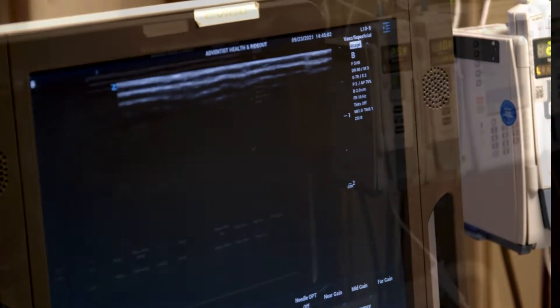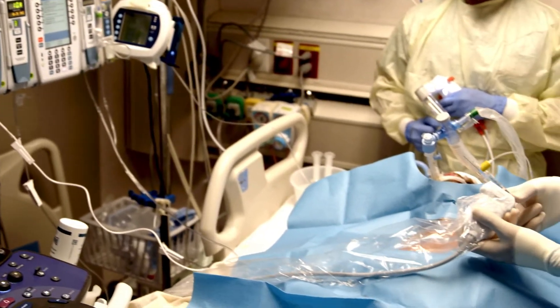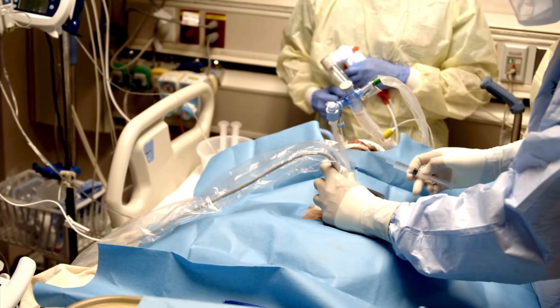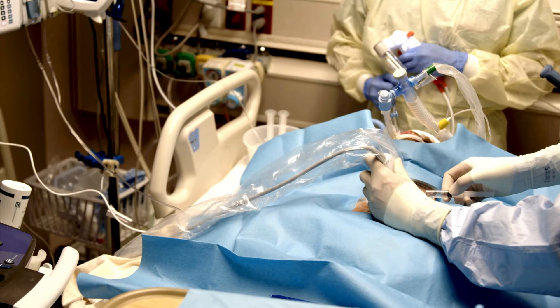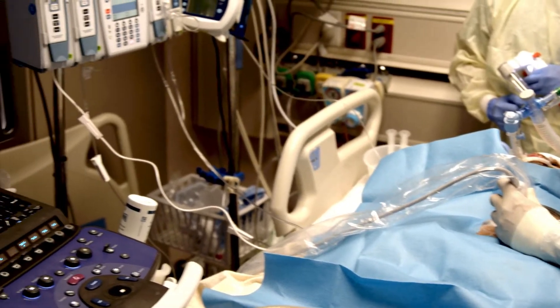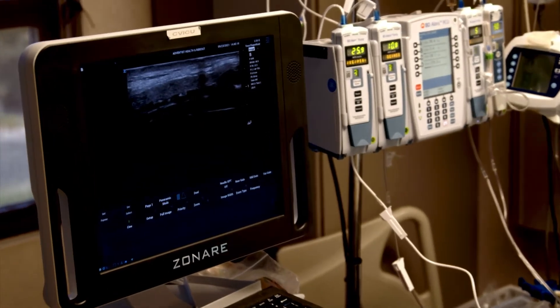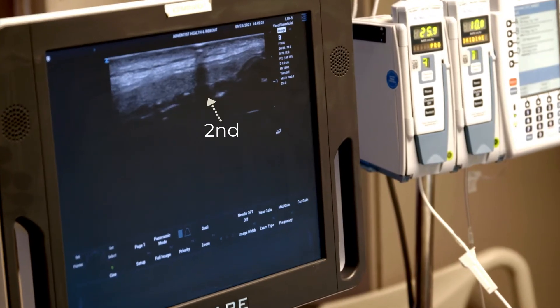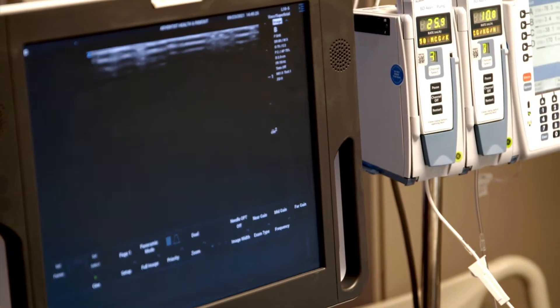Next, I'm going to use a needle to find the second or third tracheal ring and mark that spot. I have his cricoid up there. I'm going to place this needle under ultrasound guidance. There's the cricoid, there's the first ring — that's probably about his second ring right there, and that's probably about the third. So I'm going to numb up right about here.